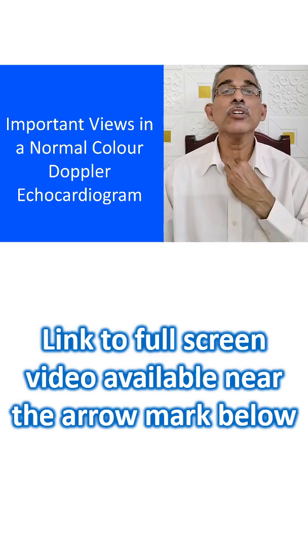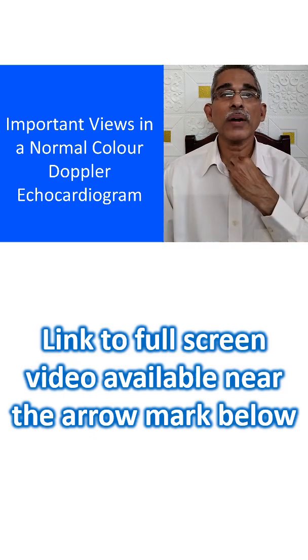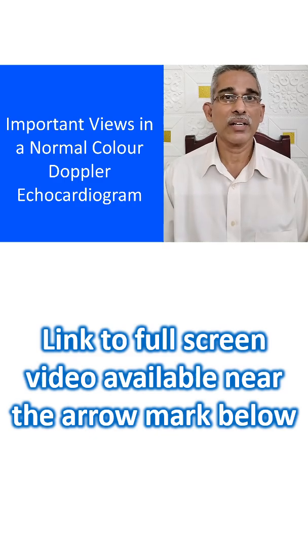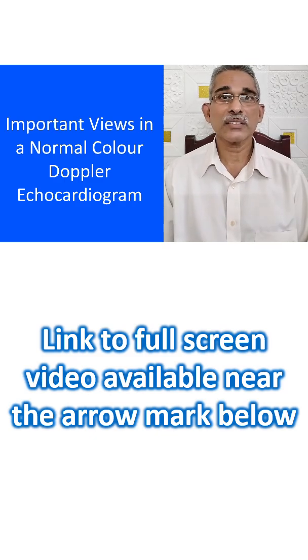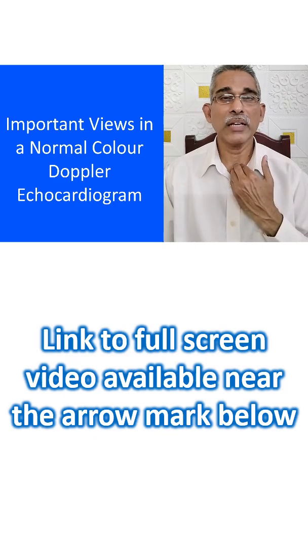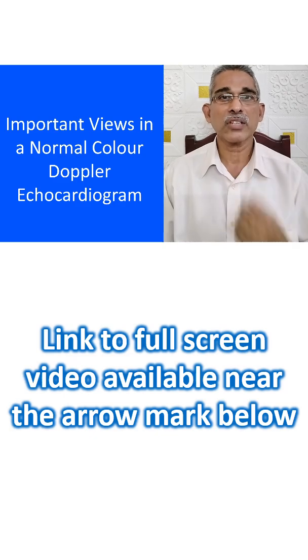The next view is the suprasternal view, mainly for the aorta — the descending aorta and arch of aorta. If there is a patent ductus arteriosus or coarctation, that can be better imaged from the suprasternal view.